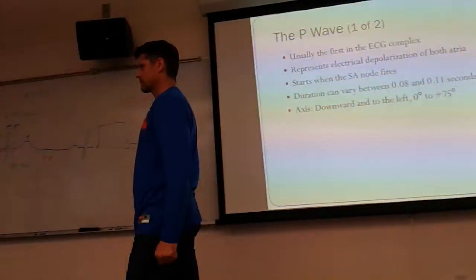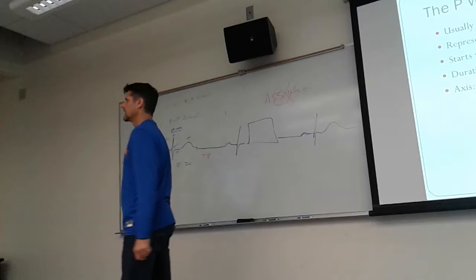So the definition of an artifact is something that you see on the EKG that was not created from the heart.